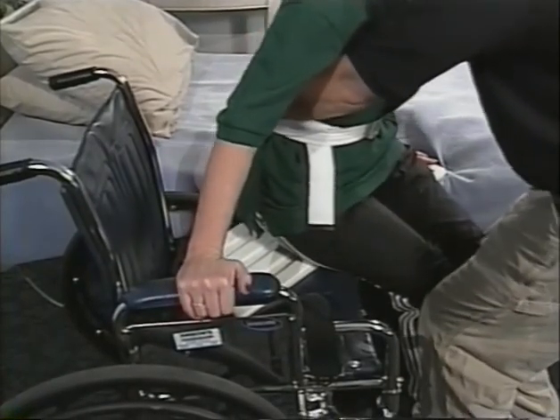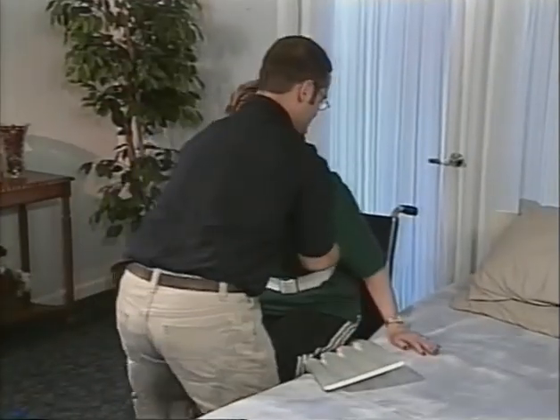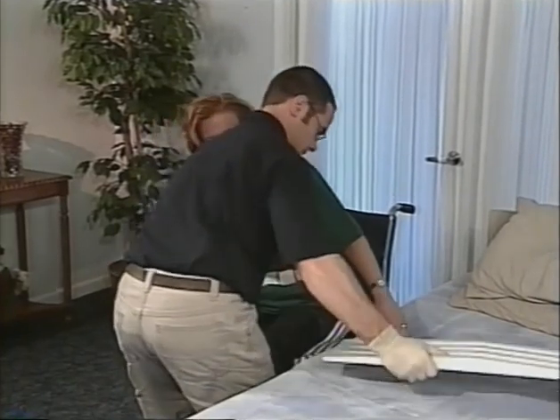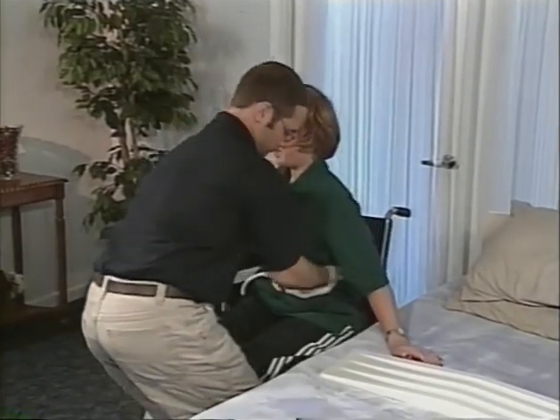Go way over. 1, 2. Position the client comfortably in the wheelchair as discussed before.